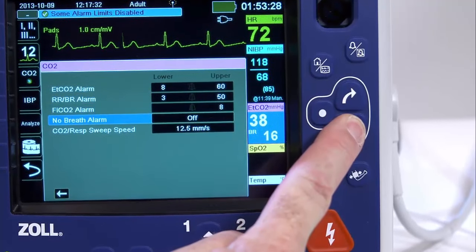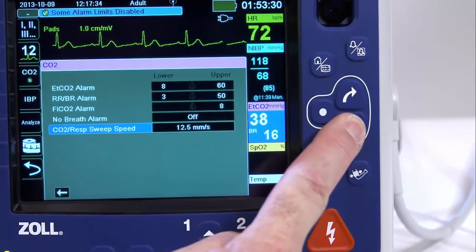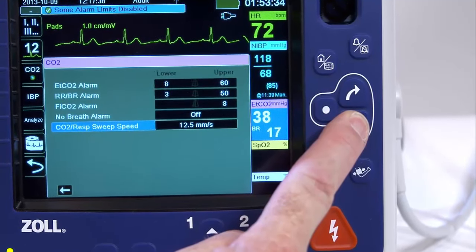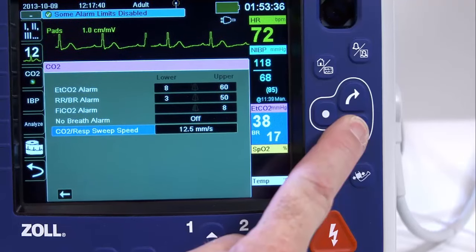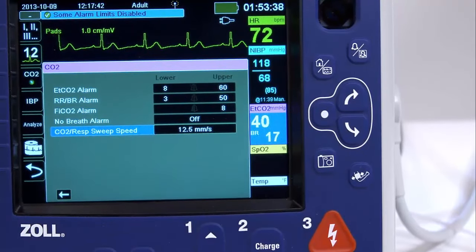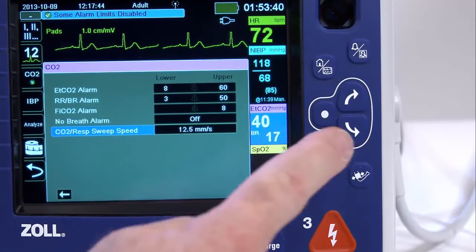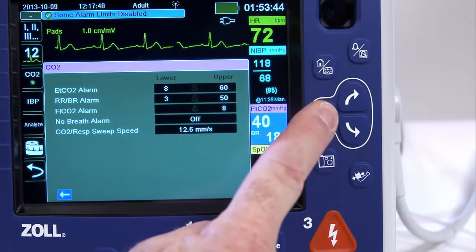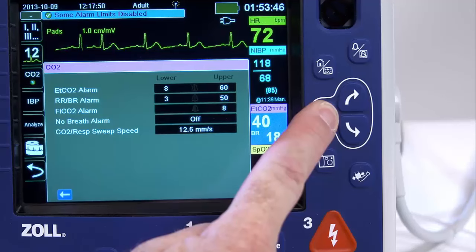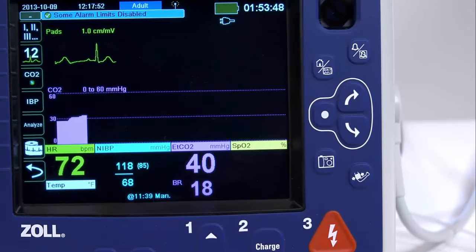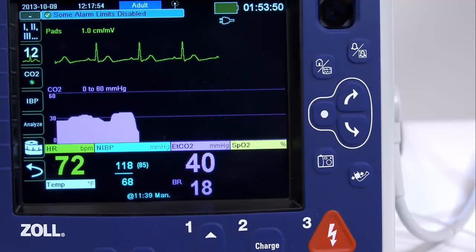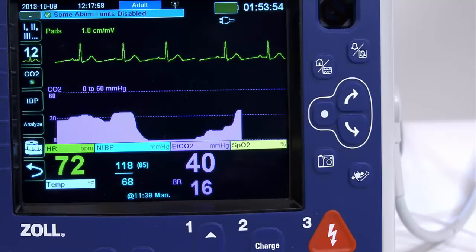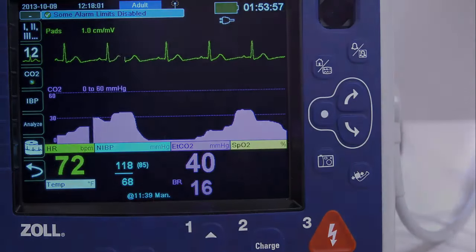Use the navigation keys to highlight and select the CO2 numeric display to see the CO2 parameter control panel. The ETCO2 sweep speed determines the x-axis scale of the capnogram. For patients with slower respiration rates, a slower sweep speed will make the capnogram easier to view. You can adjust the speed using the CO2 parameter control panel.